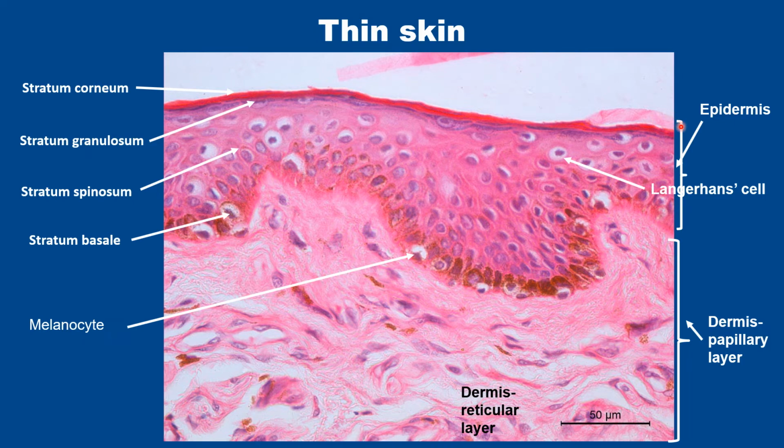You can differentiate between the epidermis and dermis here, but in the epidermis there are other cells also. See, this is a cell in the stratum spinosum, and there are a lot of spaces around it. So this is also a dendritic cell. This is the Langerhans cell, and you cannot see the typical spines which are there in the stratum spinosum cells. So two types of dendritic cells you have to differentiate.